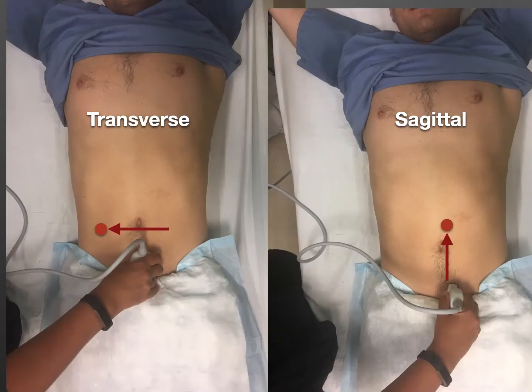Then we go on to our retrovesicular or bladder views. We do both a transverse view and a sagittal view in the retrovesicular view. Your transverse view is just above the pubic symphysis, way below the umbilicus, and you're angling the probe to the patient's feet. You have your probe marker in the transverse view pointed to the patient's right. In the sagittal view, you rotate 90 degrees clockwise, so you have the probe marker pointing towards the patient's head.